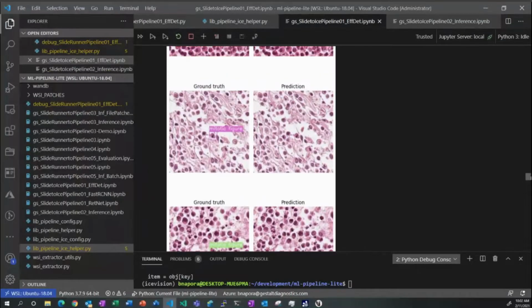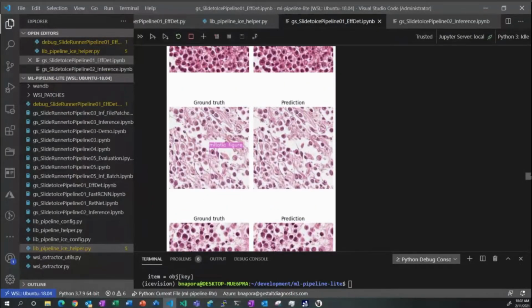Yeah, yeah. And is this the one that is doing 86? Is it doing a good job there on the image? And of course, I don't know how good the results are there. Does it make sense on the 86%? Well, there's a fair number of false positives when I do it on the broader region of interest. So haven't solved. I need to do some padding of patches.